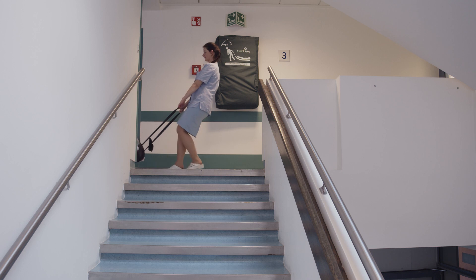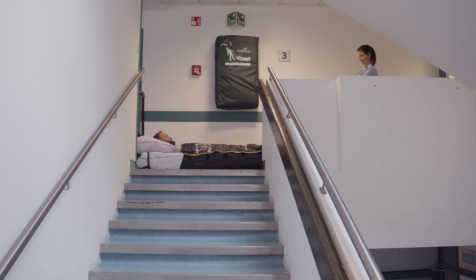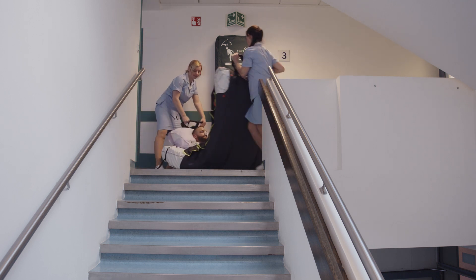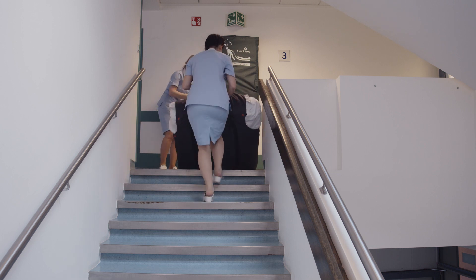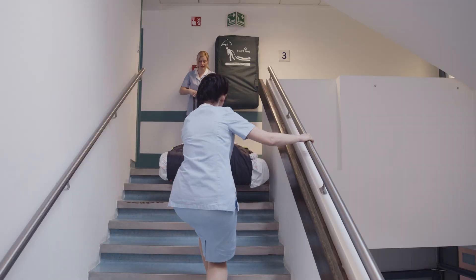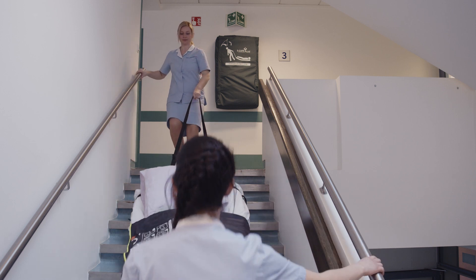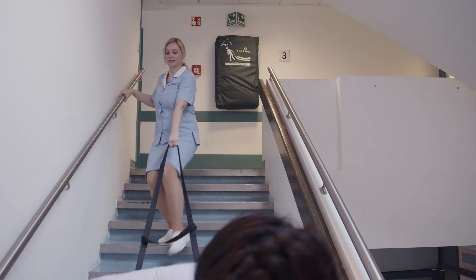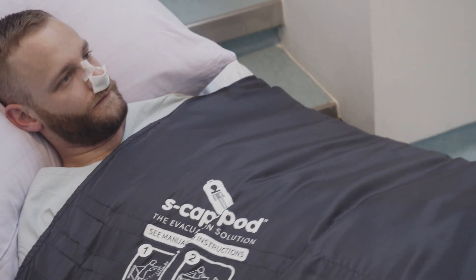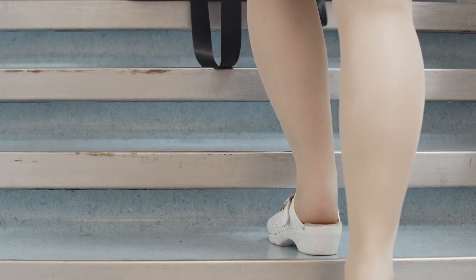If you are on a higher floor, the only way to go is down the stairs as you will not be able to use any elevators during the evacuation. Position yourself a few steps lower and pull the patient towards you. When the patient crosses the staircase, carefully lower the mat down. Always have a firm grip on the railing and keep your foot in contact with the mat at all times. Maintain eye contact with the patient and descend the stairs gradually, step by step. Do not skip any steps.